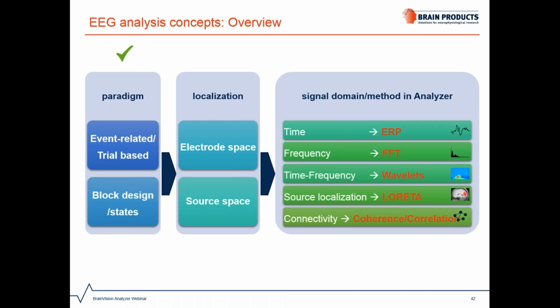Let's think about whether to analyze the data based on the electrode signal or based on estimated source signals. There are several things to consider when going from source to electrode space and back.